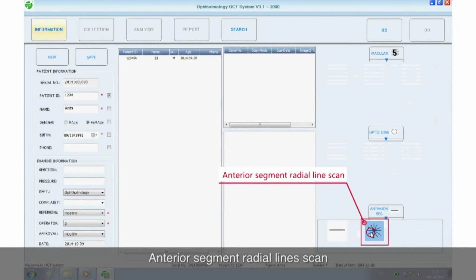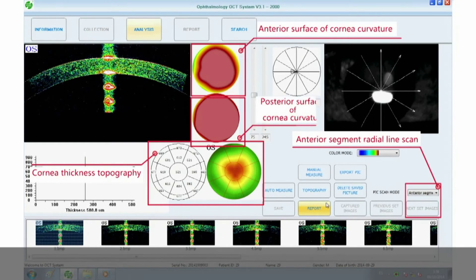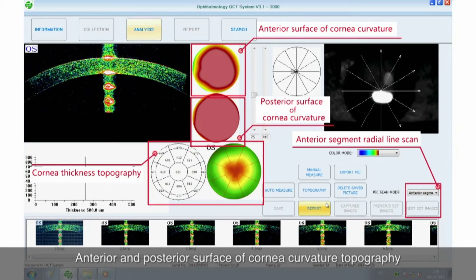Anterior segment radial line scan will generate cornea thickness topography, anterior and posterior surface of cornea curvature topography.